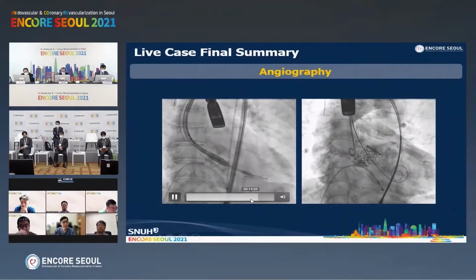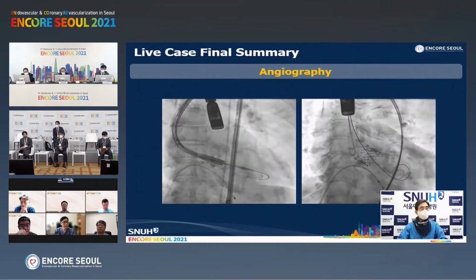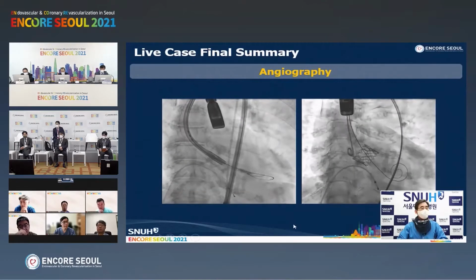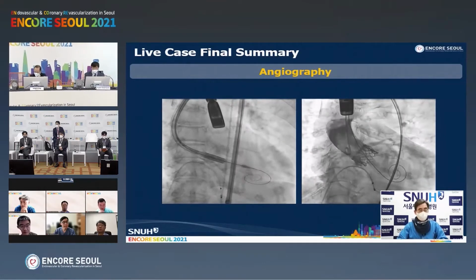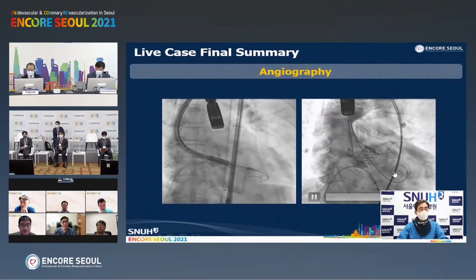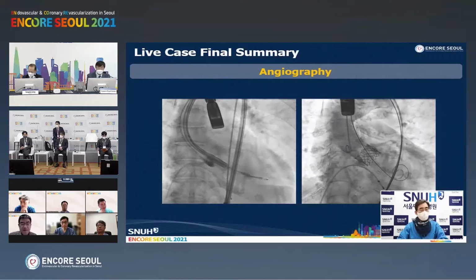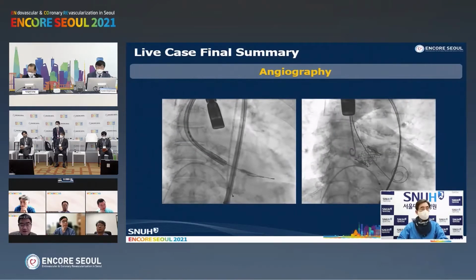It's always painful to send the patient to surgery after a procedure, but I believe you made the right choice. I hope everything goes well. I did not perform a pre-balloon. If I had performed the pre-ballooning, it may not have happened. That is a very interesting case. This is the first case of sinus valsalva tear in my 385 cases. Thank you very much for your attention.